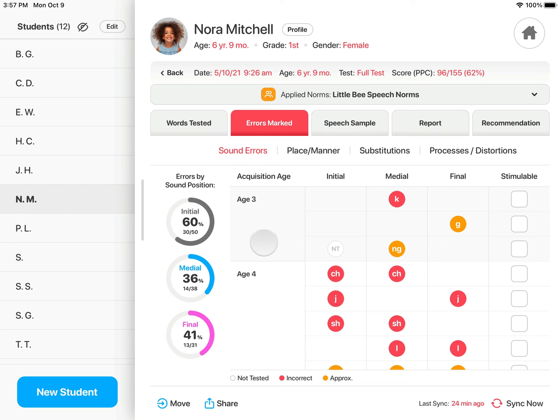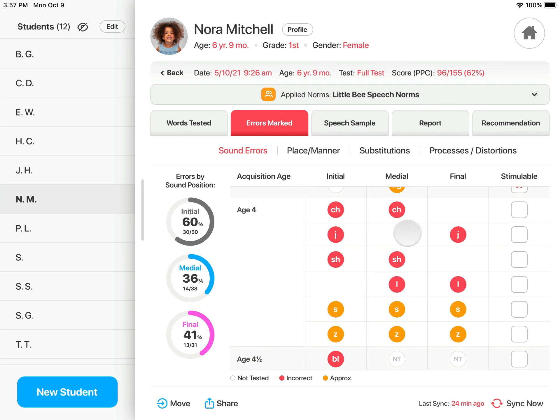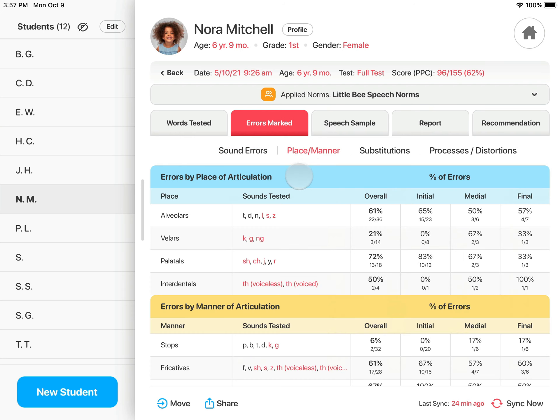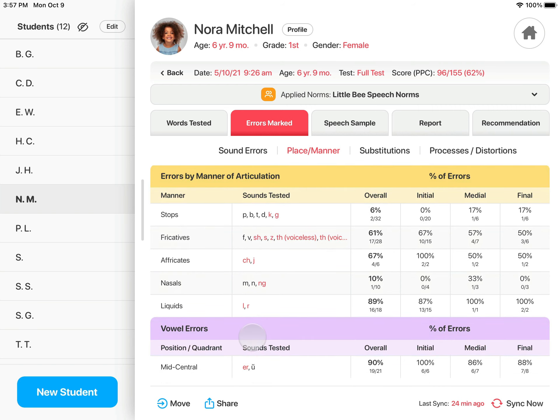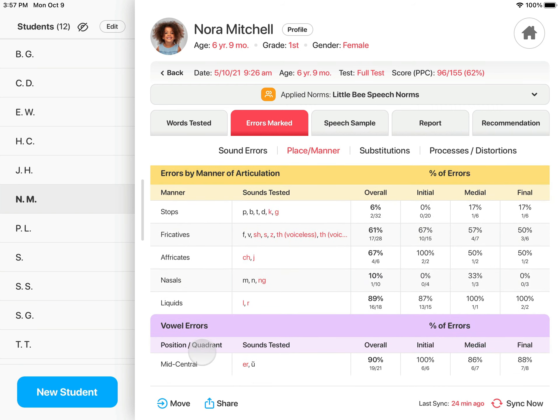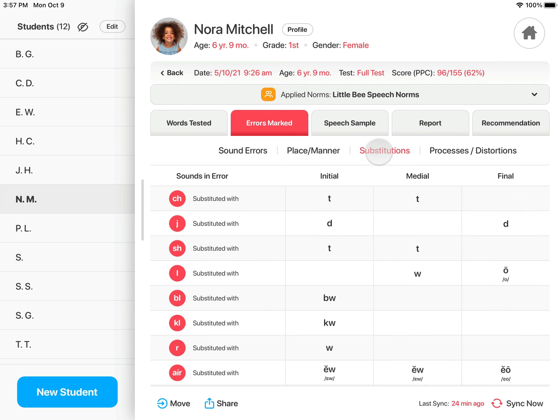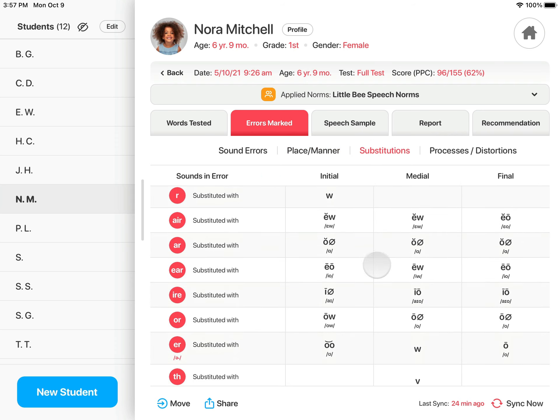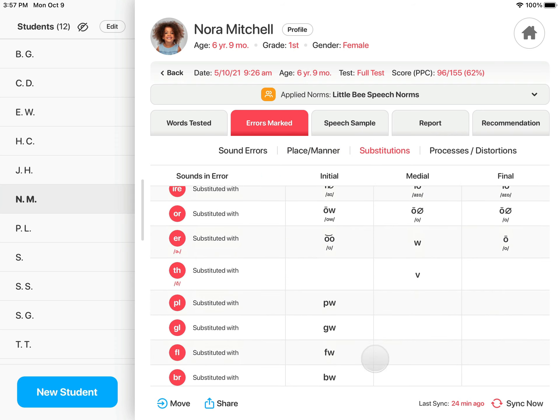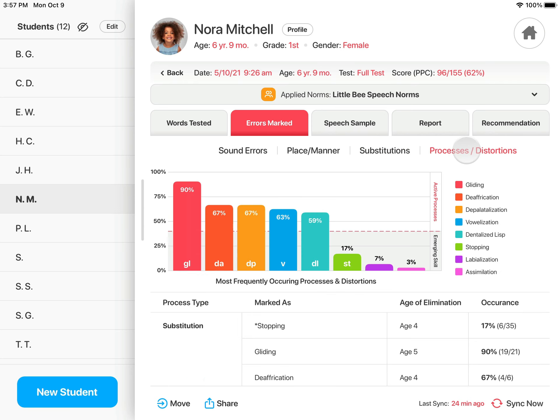The sound errors are organized by sound position and age of acquisition. On the left is an overall percentage of errors by sound position. On the right, you can easily mark sound errors for stimulability. The Place and Manner tab organizes the sound errors by place of articulation and manner of articulation. Vowel errors are also reported by position and quadrant. The Substitutions tab displays all the substitutions and omissions marked.